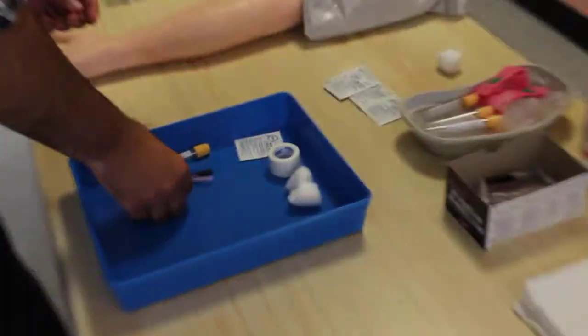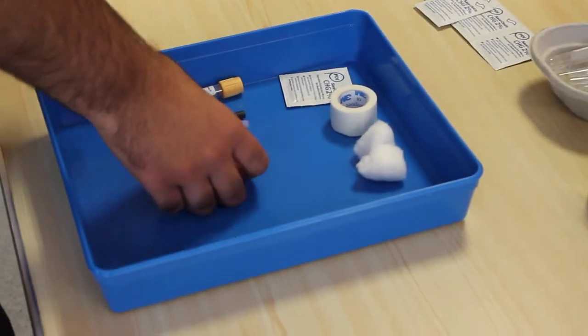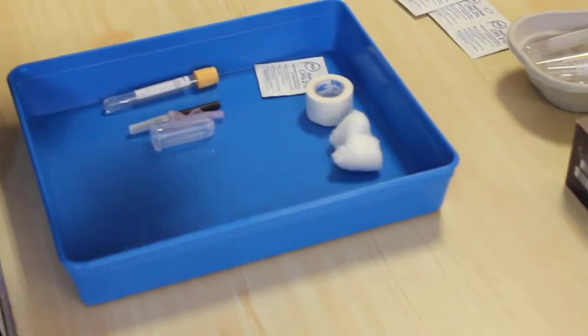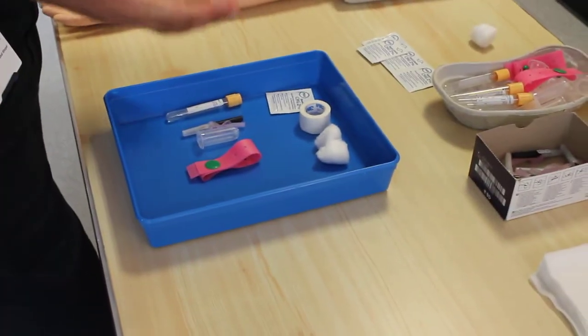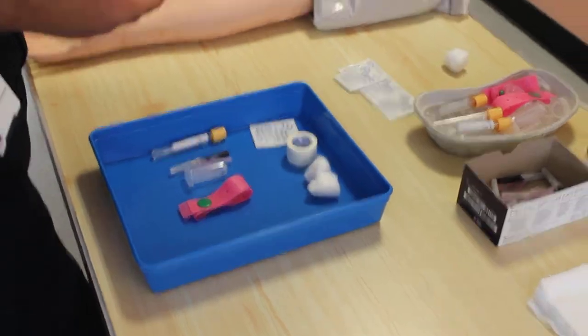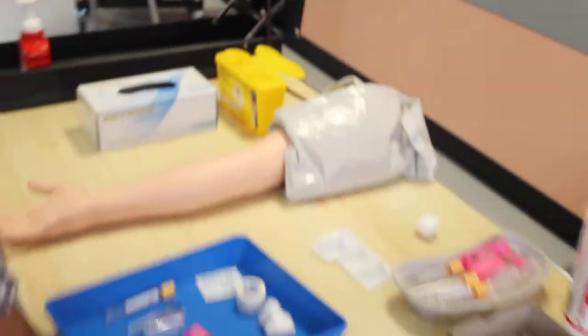The needle, the vacutainer, and the tourniquet. That's a complete set of things you need. You also need a sharps bin and a clinical waste bin to throw the rest of the stuff.